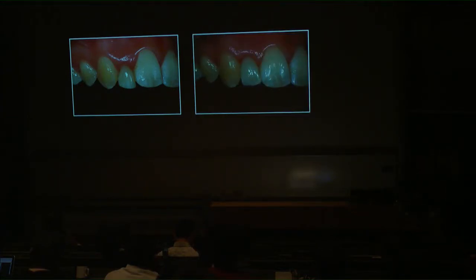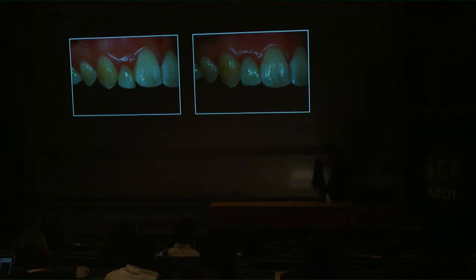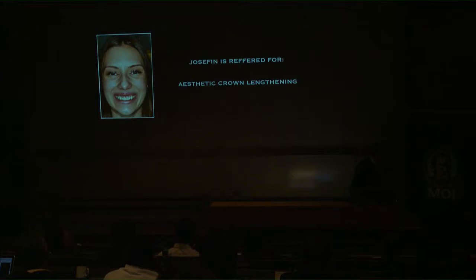So the first easy case, this is actually not done by me, it's done by my colleague Michael in my office. Tooth number 12 is placed with the root quite far back to the palate, and it's an easy treatment because there's no buccal bone interfering with reducing the soft tissue. So he's just used the laser and placed a 100% additive veneer on top, and this is like a 2-year result. But then here is Josephine again.